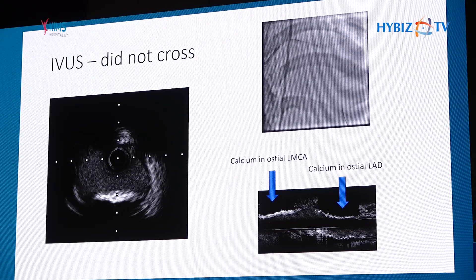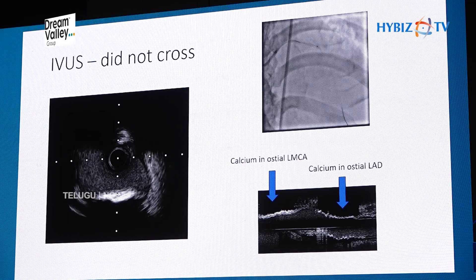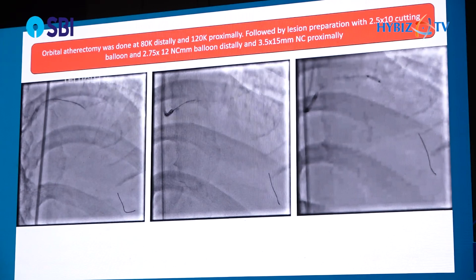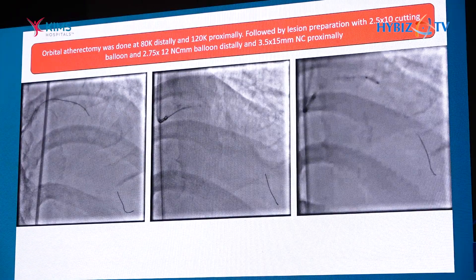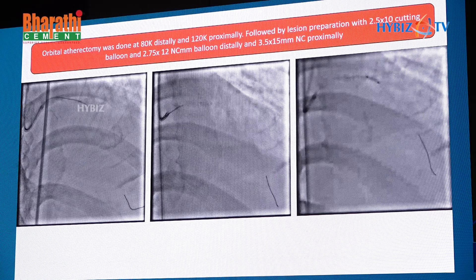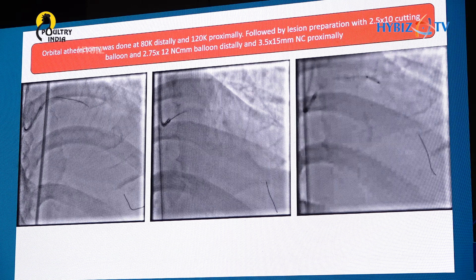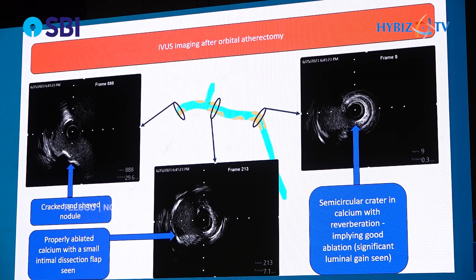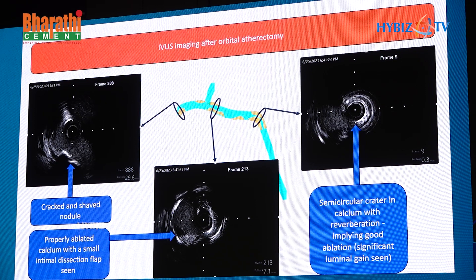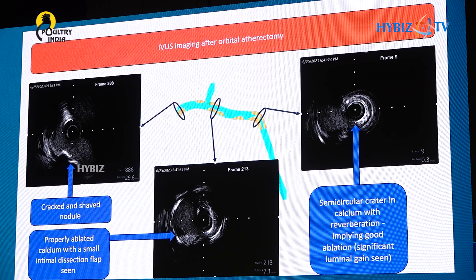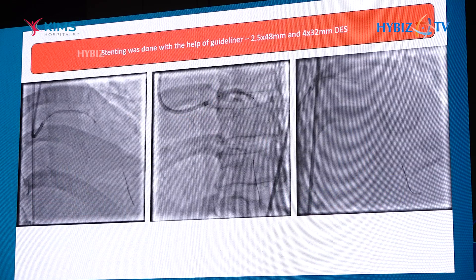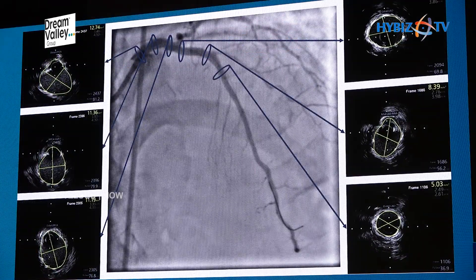IVUS was attempted but was not crossing. There is significant calcium at the ostial LMCA as well as the ostial LAD. Orbital atherectomy was performed with very slow advancement of the bur across the bend. The bur got stuck a couple of times but was gradually pulled back using reverse ablation. The distal part was ablated at 80k RPM and the ostial LMCA part at 120k RPM, followed by preparation with cutting balloon and NC balloon. IVUS images show a clear crack and shaving of the nodule in the LMCA, significant luminal gain in the proximal LAD, and a crater at the bend with reverberation artifacts confirming adequate debulking. Stenting was done with guideliner with very good results, and post-IVUS results were excellent.